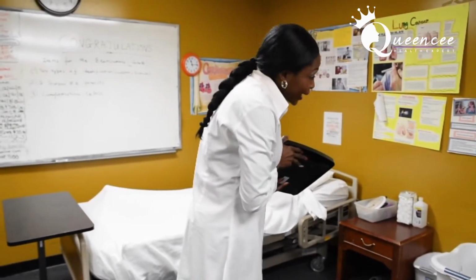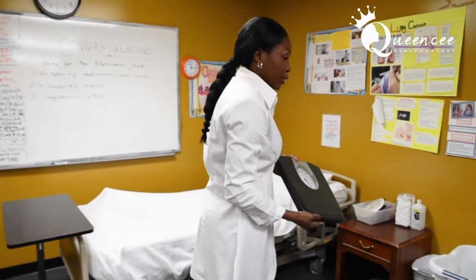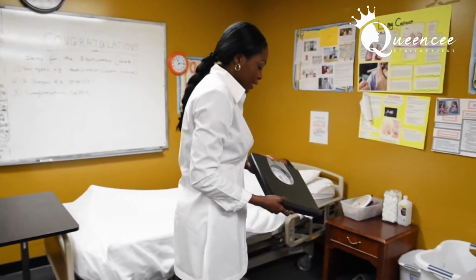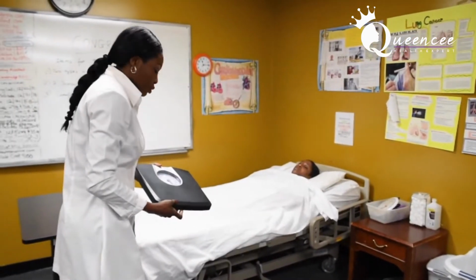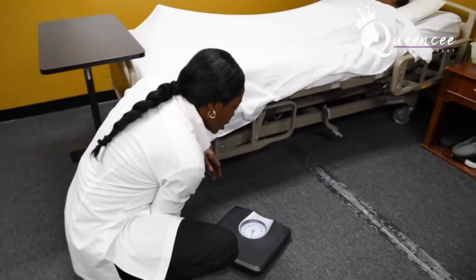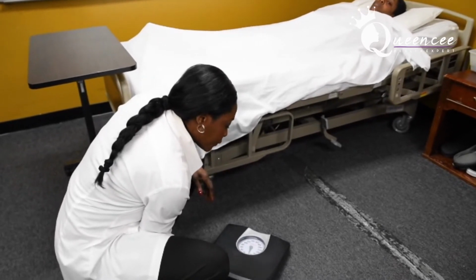So before I start the scale, I'm going to pretend I'm the examiner. There is a line here that the examiner is going to move to take the scale from balance to out of balance. When you bring your scale to weigh your patient, you're going to set the scale on the floor.